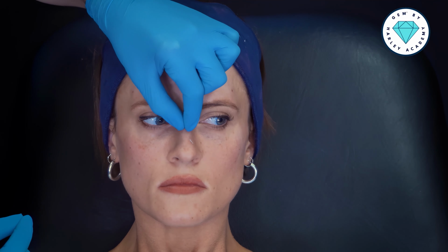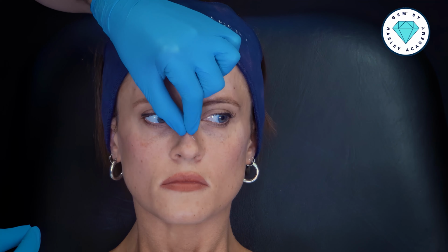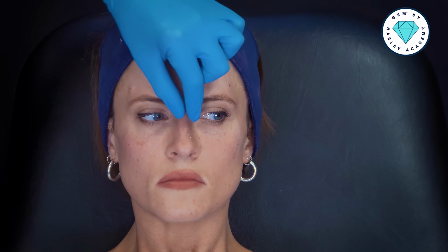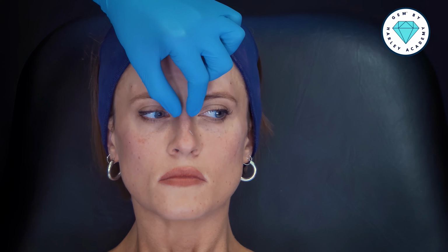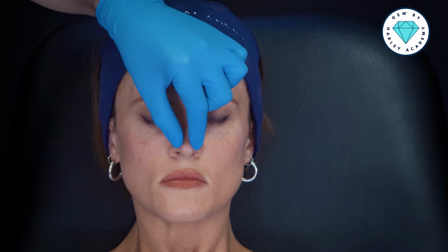We also need to assess the envelope of the skin of the nose, and it's a tight skin envelope, which means that we have the capacity to create definition. If someone has quite lax skin around the nose, sometimes they're not the best candidate for hyaluronic acid filler because we struggle to create the definition just under the skin that we're trying to achieve.